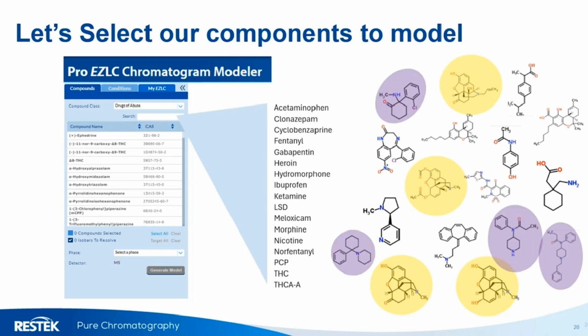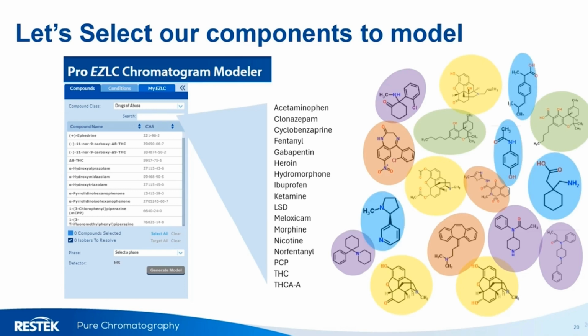You can see these similar compounds where the rings aren't fused, but also aromatic character is provided, which is common for many drug compounds. Here's some other similarities on these THC like compounds, aromatic compounds with hydrophobic tails. We can see some other similarities here with these compounds, and again, additional similarities shown here.